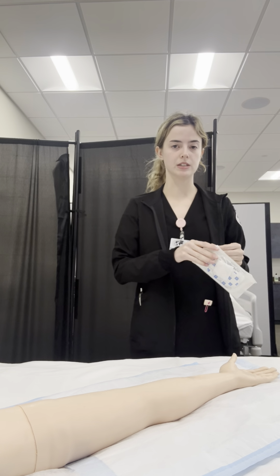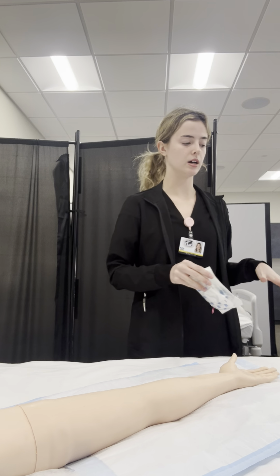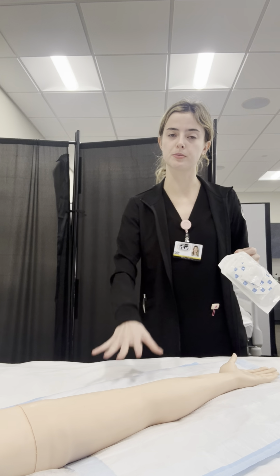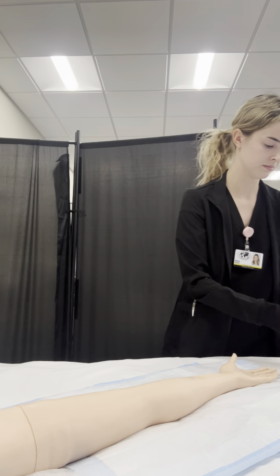I am going to assemble all my equipment. This is going to be my table. I would wipe down this table before I would lay out all my equipment. And I have a pad under my patient's arm, and I have already placed that. So I'm just going to go ahead and open my equipment.